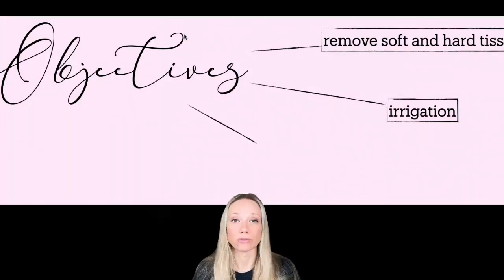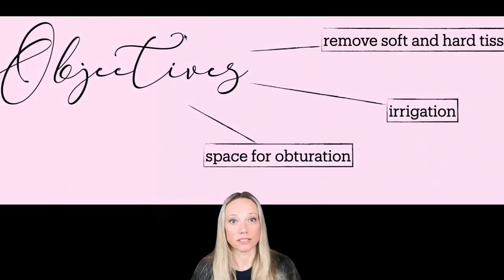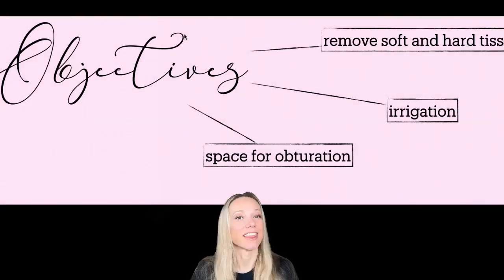And then what do we have to do? We have to make it possible to obturate the root canal system. And nowadays we have very good systems that allow us to manage even the thinnest and most conservative preparations. But if we cannot fit our obturation system into the preparation that we did, then it doesn't make any sense, because we need to obturate the root canal system to prevent the recontamination of the root canal system itself by the bacteria. And so this is another important step.